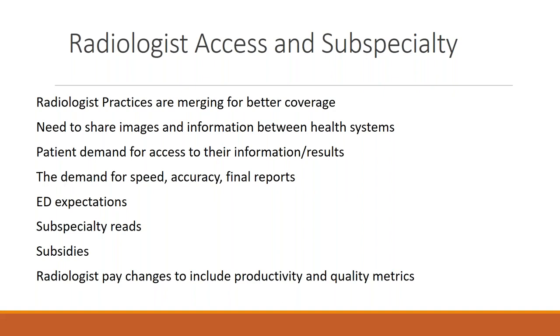The demand for speed and accuracy. We went from hours to minutes. It actually went from days to hours to minutes. And the margin of error is slim. The requirement, if you're a stroke center, to have a 60-minute door-to-needle treatment leaves about, if you split it up equally, about 20 minutes for the radiology department to do their thing, from the time they get an image to get it sent over, get it read, and get a report back and called to the doctor for a stroke program. So speed and accuracy are incredibly important and not achievable without the infrastructure of IT.